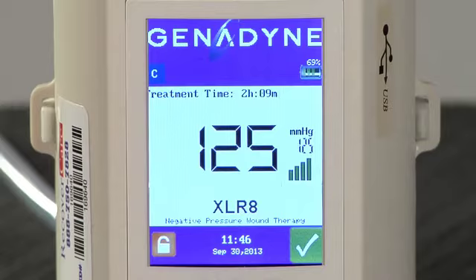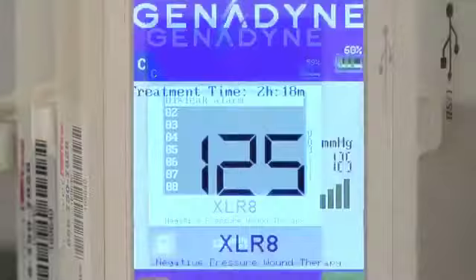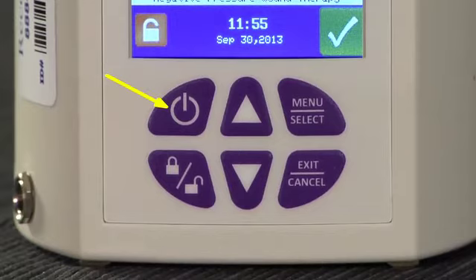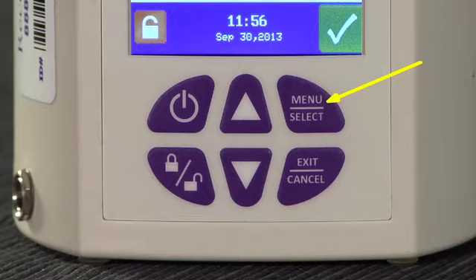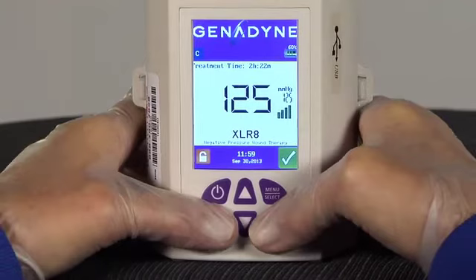Should an alarm be activated, the check mark will be replaced with an exclamation mark in a red triangle. There are 6 buttons on the keypad used to enter pump settings. The on-off button is used to turn the device on and off. The up and down buttons are used to increase and decrease suction pressure, and are also used to scroll through screen menus. The menu select button brings up the system menu and allows the selection of desired pump functions. The lock-unlock button locks the keypad, reducing the risk of tampering with the device settings. To lock the device, simply press and hold the lock-unlock button and the exit-cancel button simultaneously for 3 seconds.